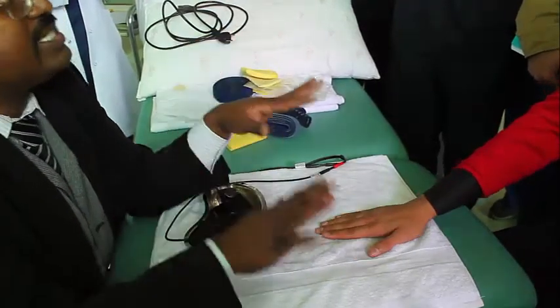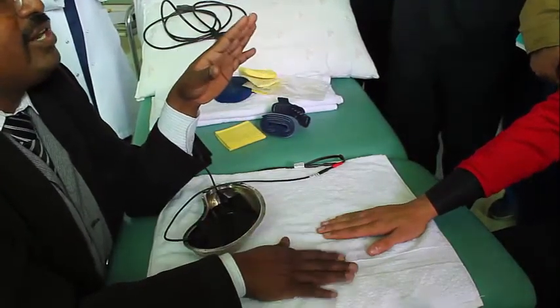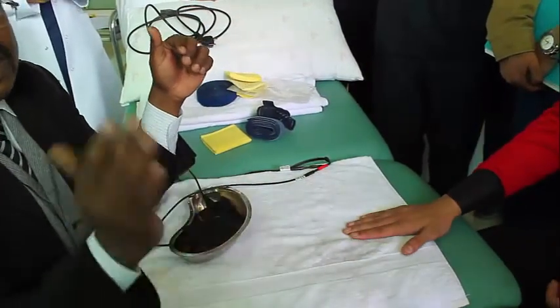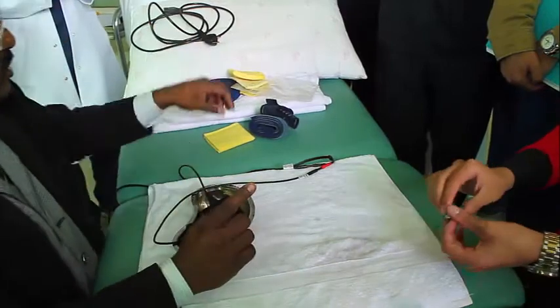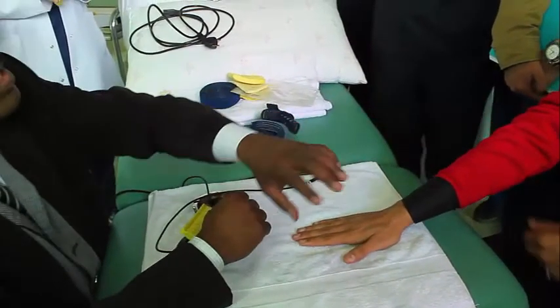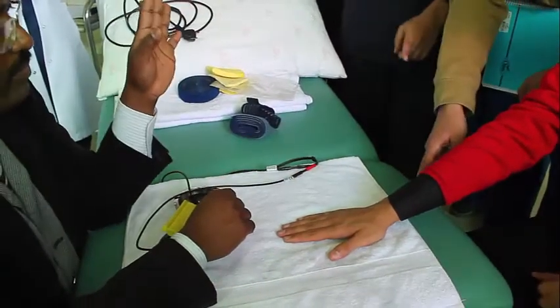So you have to decrease the resistance of the skin. That is the reason you have to do this. So the next step is how to decrease the resistance of the skin. The first thing is you have to remove all the metals related in that particular area.